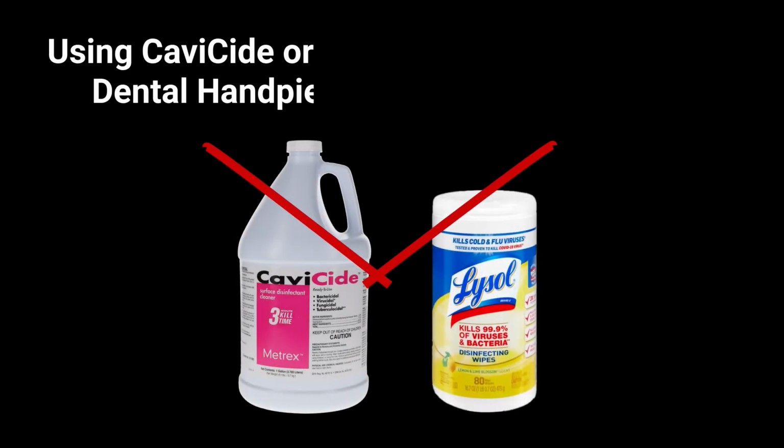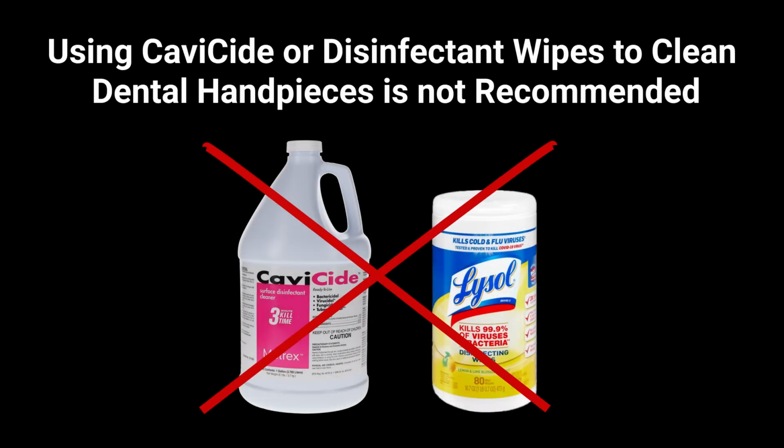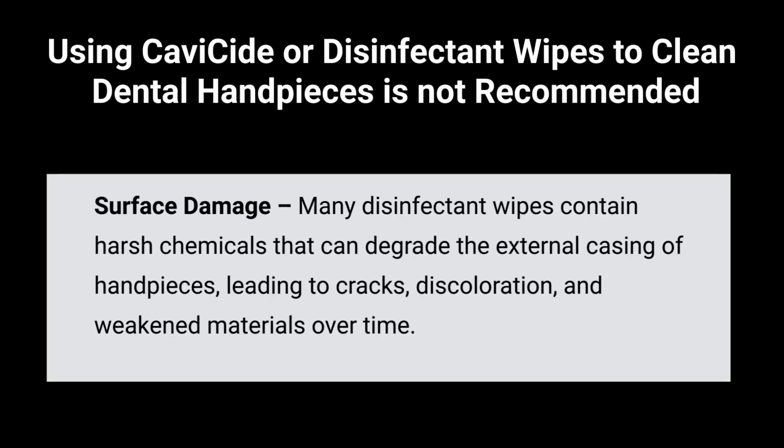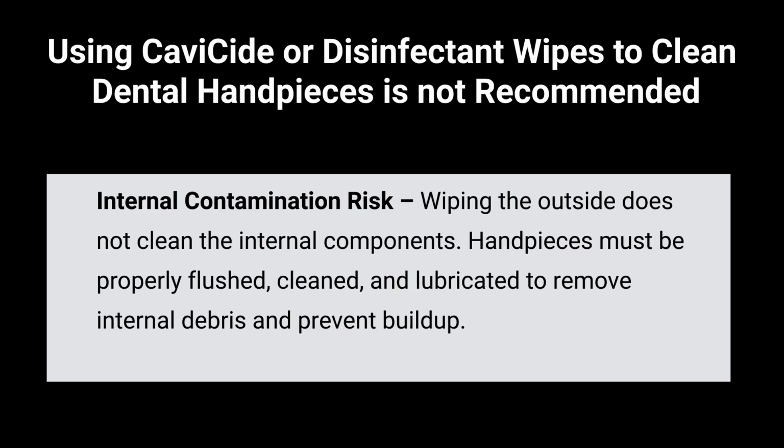Using cavicide or disinfectant wipes to clean dental handpieces is not recommended. Surface damage: many disinfectant wipes contain harsh chemicals that can degrade the external casing of handpieces, leading to cracks, discoloration, and weakened materials over time. Internal contamination risk: wiping the outside does not clean the internal components. Handpieces must be properly flushed, cleaned, and lubricated to remove internal debris and prevent buildup.